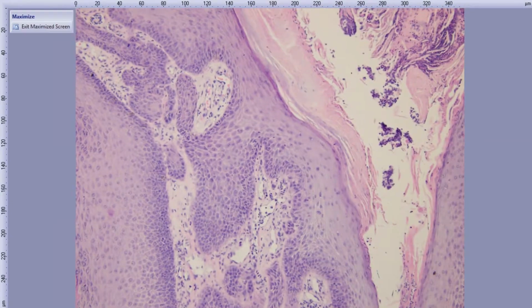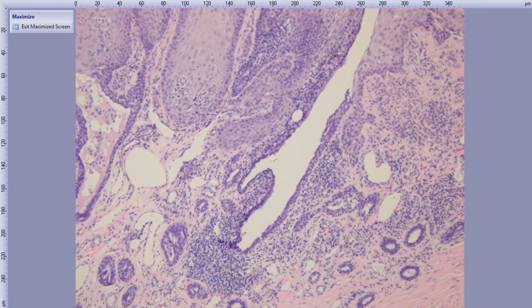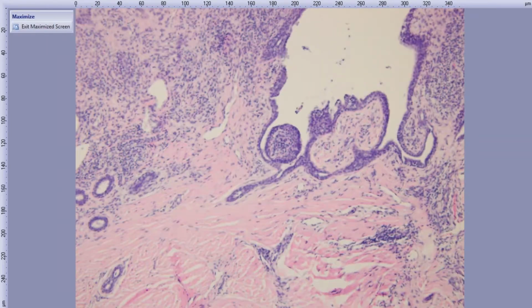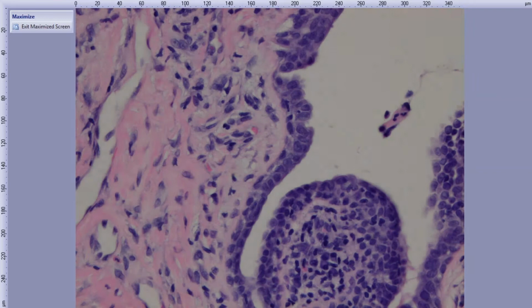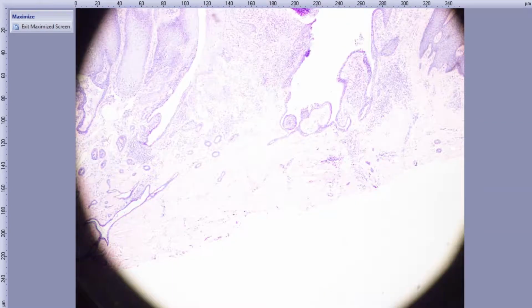So you can see a transition from the normal skin here into the apocrine lining, and then also we've got these papillary folds right here. And I think earlier I showed you, and I'll show you again here, plasma cells. Let me brighten that up. And there are several plasma cells with the eccentric nucleus and pale perinuclear area. So this is a real nice syringocystadenoma papilliferum.